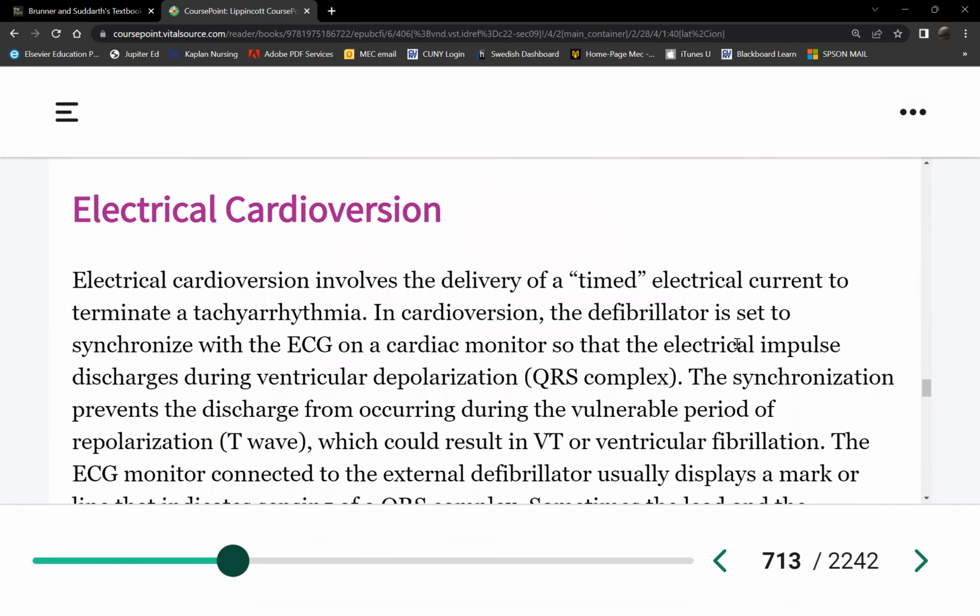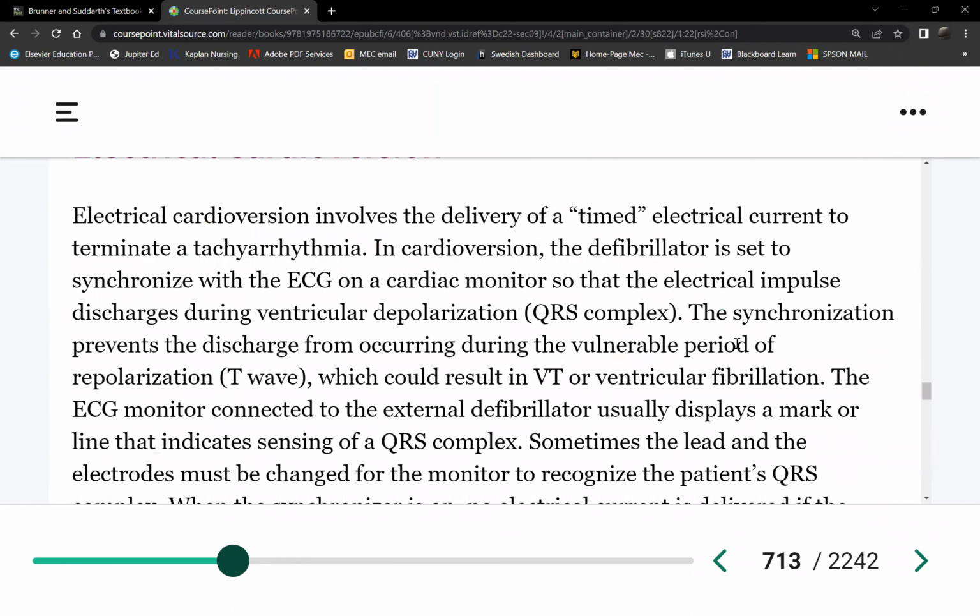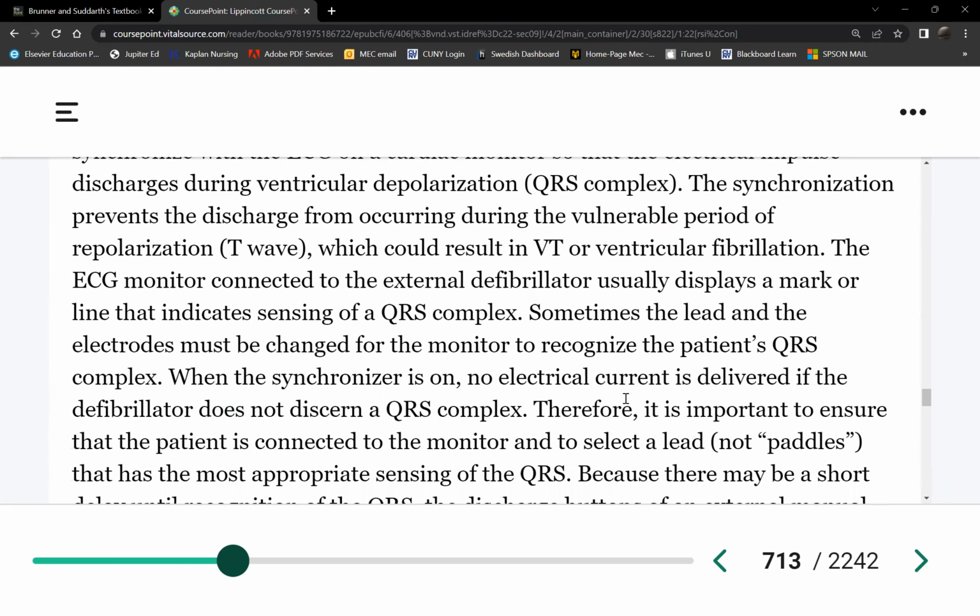And here's the cardioversion. Again, what is done before we do this? What should be given to the patient? The patient here is awake, right? Because this is scheduled. We sedate the patient, and then we do the cardioversion. Do we need consent for this? Yes, because this is rarely done in an emergency. And again, the patient is awake when we do cardioversion, so we can explain, get consent, and then do the procedure. We can sedate them pre-procedure.